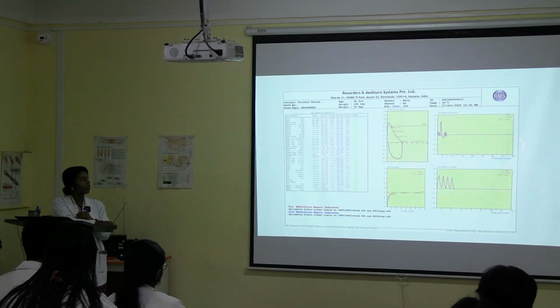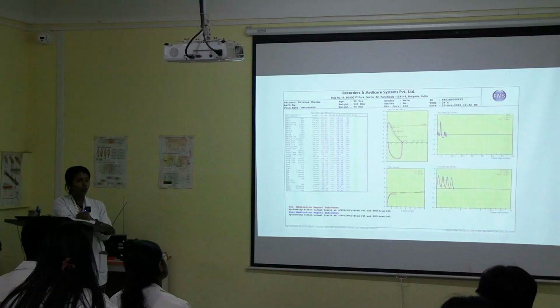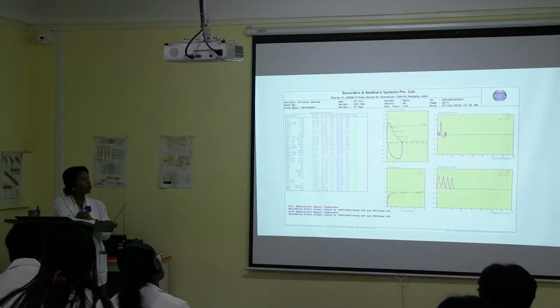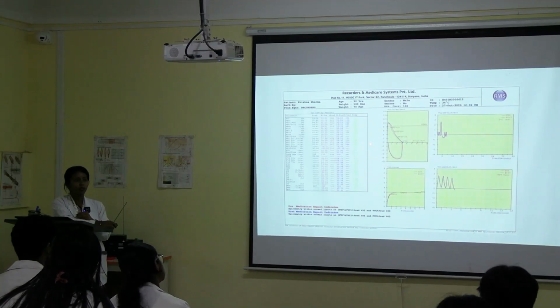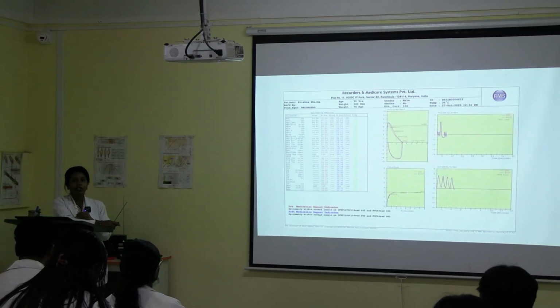So this is the graph in the Helios spirometer, digital spirometry. Digital, that is computerized. You will be obtaining the flow volume loop. Are you aware of this loop? Flow volume loop. We will be recording the person's age, height, and weight.